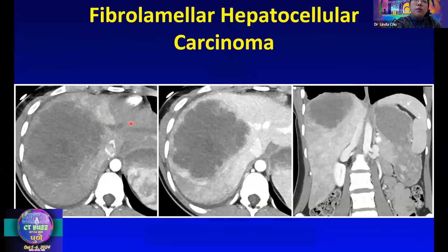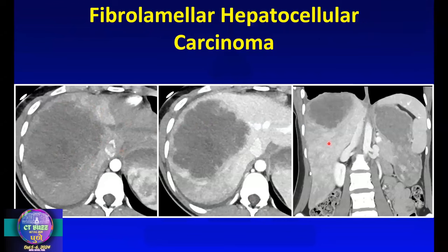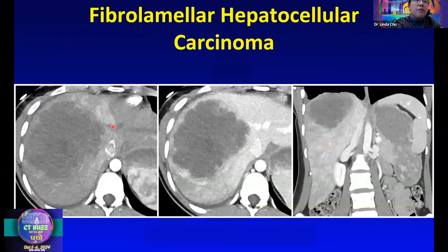Here is another example of fibrolamellar HCC. This case is more hypo-enhancing rather than hyperenhancing, and it doesn't quite have a central scar, so it would be very hard to call this fibrolamellar HCC with confidence. However, going back to the decision of benign versus malignant, this mass has heterogeneous enhancement and scalloped borders, indicating aggressive features — so I would go down the malignant path right away.